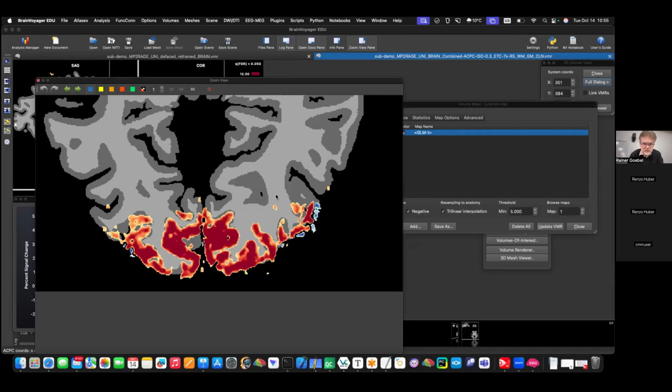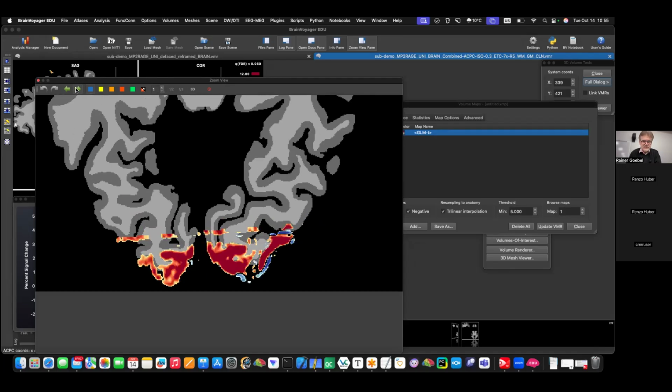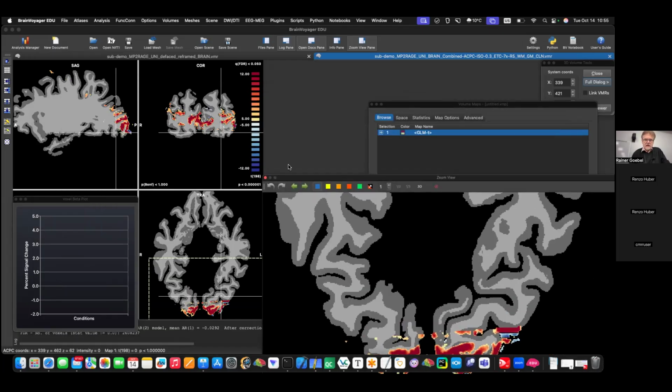Looks slightly better on VASO, but it looks pretty nice. So now I have sent you also, just to save a bit of time, because we have only 5 minutes, I prepared 2 regions of interest, right, which we can load. And then we can directly do the laminar stuff. So you know what regions of interest are?